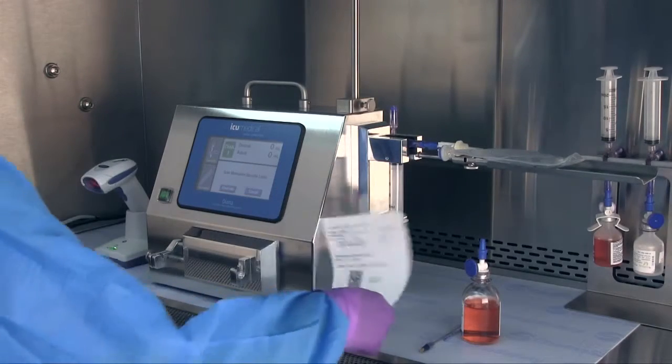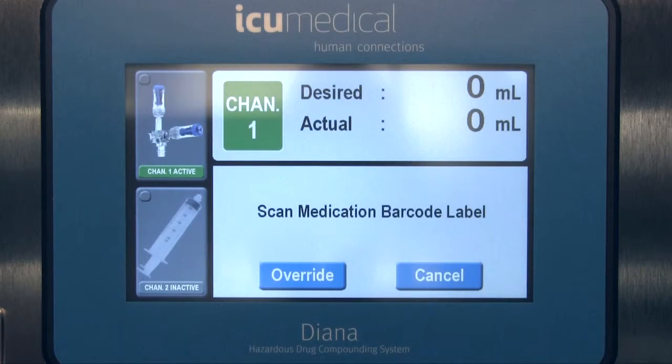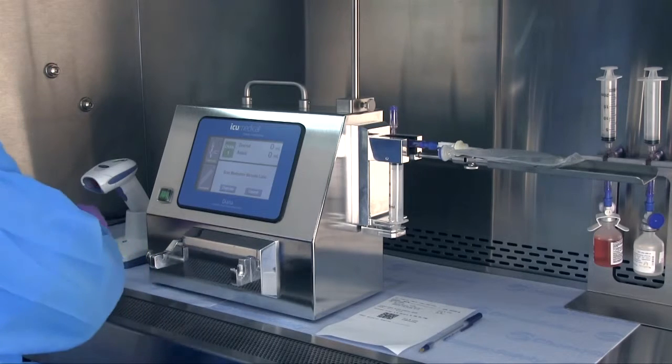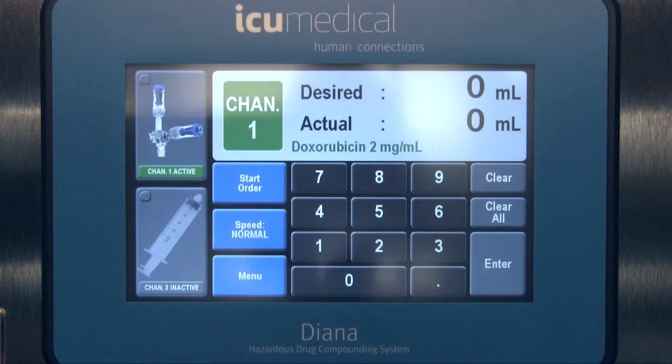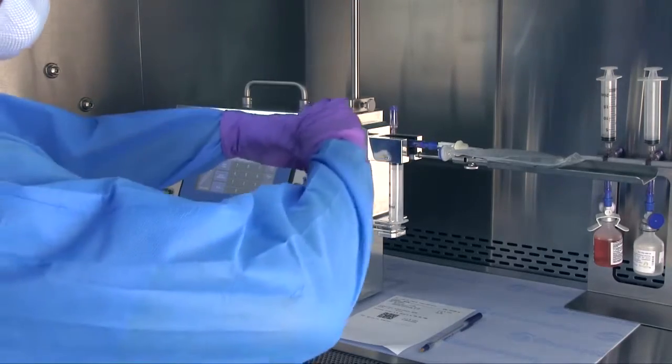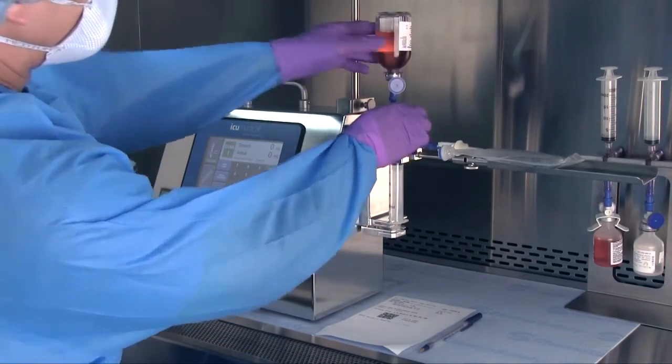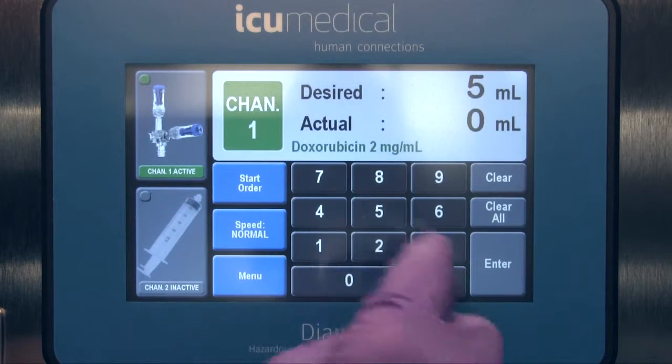After scanning the patient order, another on-screen prompt will direct you to scan the medication barcode. Scan the medication's barcode by placing the container under the scanner and Diana will display the medication name and concentration on the screen. When you're done scanning the medication, attach the drug vial to the Channel 1 cassette and enter the desired volume of drug to transfer to the patient container.